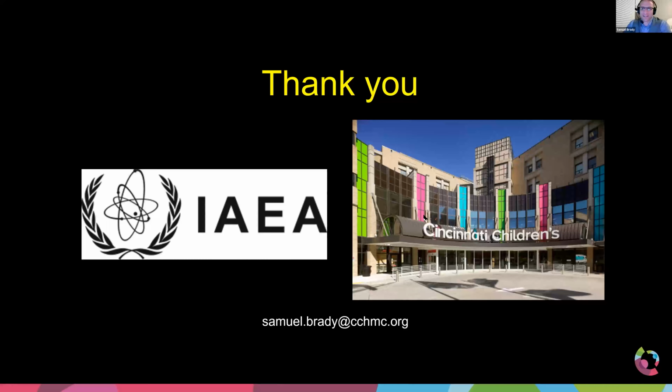And thank you for clarifying, because you may have misinterpreted what I was saying when I said don't do low kV for non-contrast images. It's normal populations, and we don't want to give too much radiation to the normal population, right? That is the key. Especially if they have a history of smoking, and now they're going to start going in once a year or once every other year, depending on what the protocol is. If they're going in to get a CT chest for the next 20 years of their life, we don't need to use a lot of radiation.